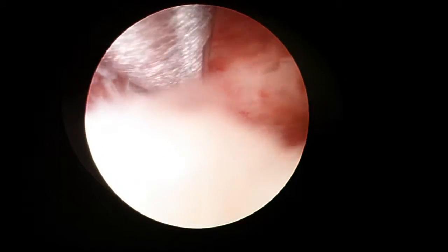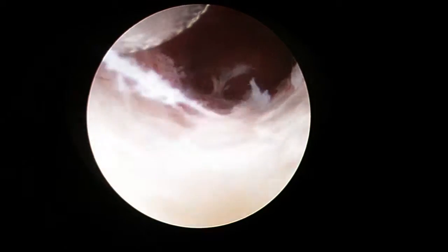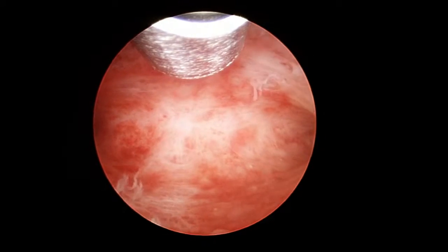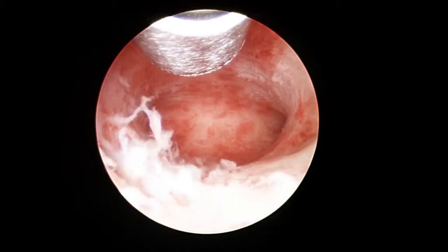Residual scar tissue and small polyps are removed from along the uterine sidewall and endocervical canal and sent to pathology from the MyoSure device tissue trap. The video shows the upper uterine cavity, and both ostia appear normal.